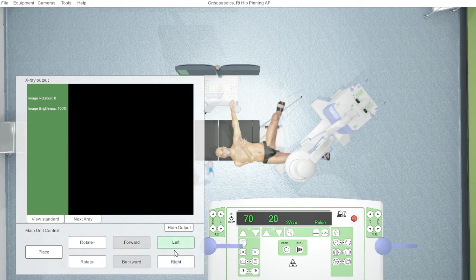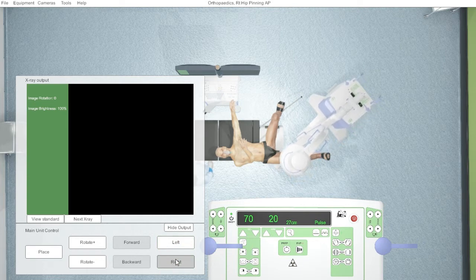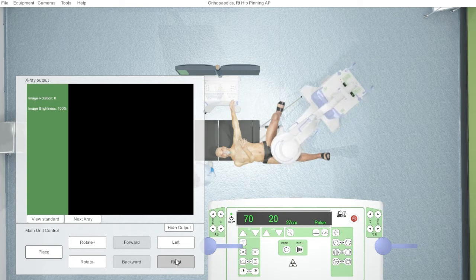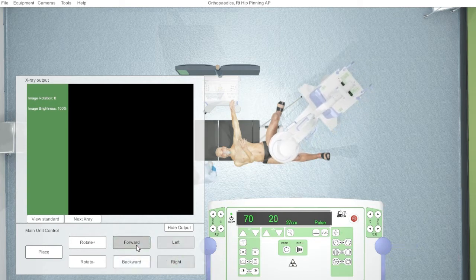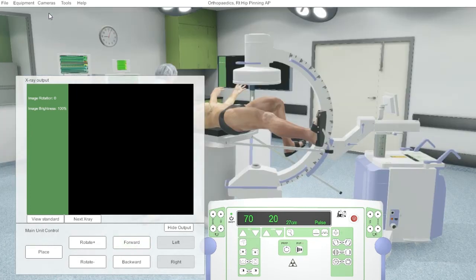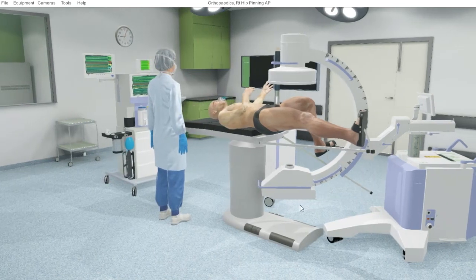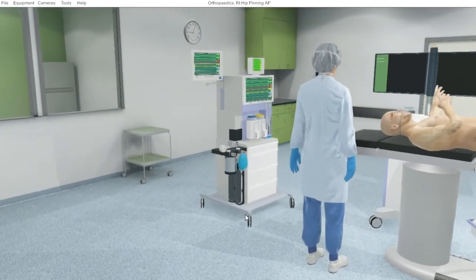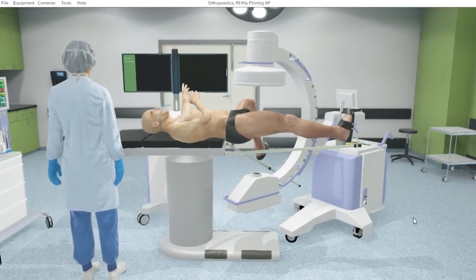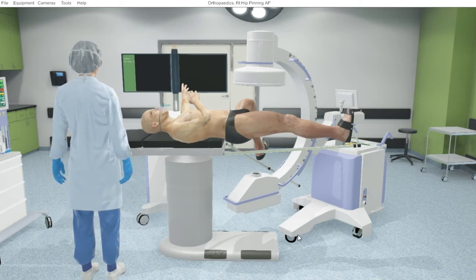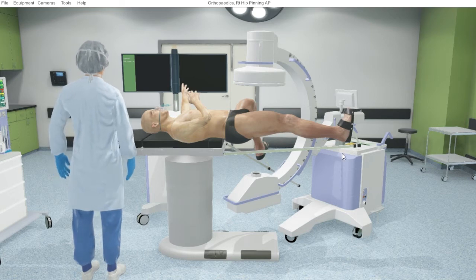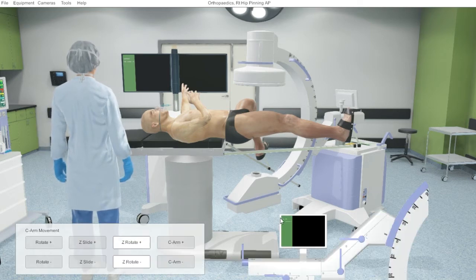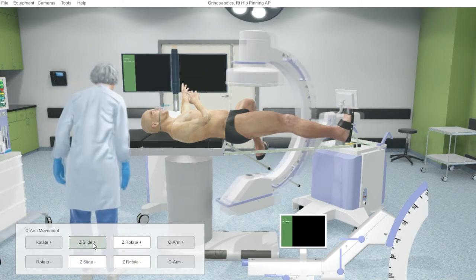As a radiographer, we need to be careful that the C-arm or the equipment does not hit the table, the patient, the sterile field, or the surgeon. So we may have to change our positioning and see what it is that's stopping the machine from moving. As you can see here, the base of the machine touched the base of the table, thus not enabling the base to go further in.